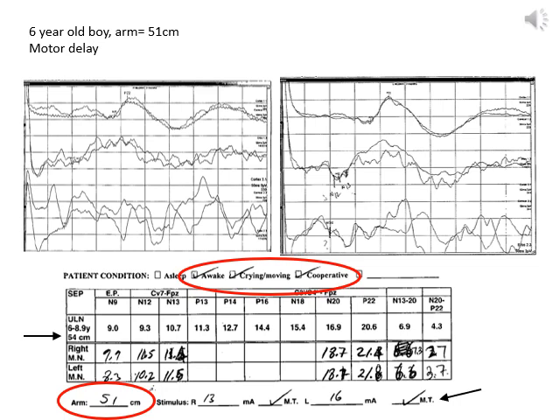Before we look at the tracings, we start with the table. And so we notice that the tech has marked for us that the child moves between being awake, crying and moving, and cooperative. And so this explains the quality of the tracing that we see, that there's a bit of noise in the cervical and peripheral recordings. This may be due to the child crying and moving and being awake. Although the cortical responses, which are a little more robust to movements, are quite clean and reproducible.